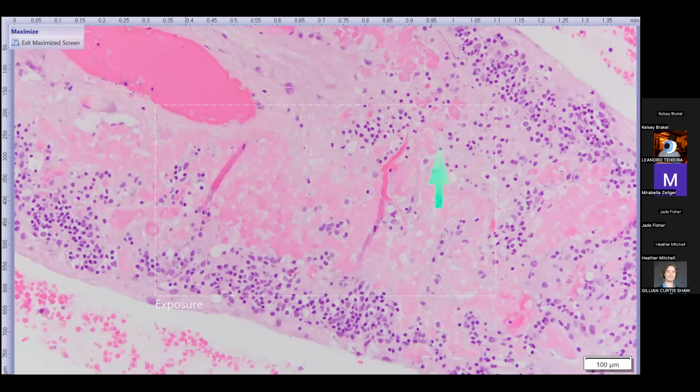And then from the mass that y'all got earlier, I could make a case for this being osteoid as well. I mean, just because I'm not used to seeing it. Do you think it's connected at all to that mass? We don't have any of those neoplastic cells here. Yeah, but that's a good thought. Good thought, but I think it was mainly orbital. I don't think there was any history of intraocular. And it would have been weird for the osteoid to be just in the retina like this. Yeah, okay.